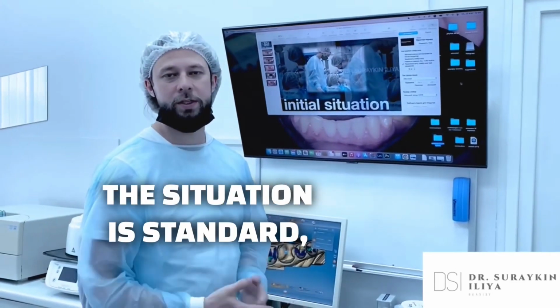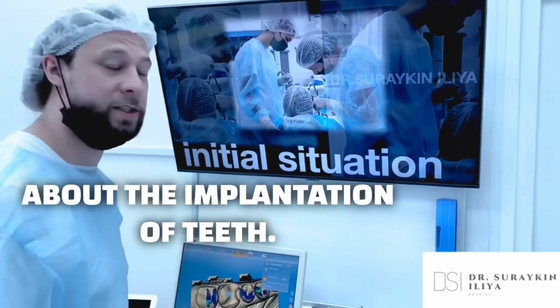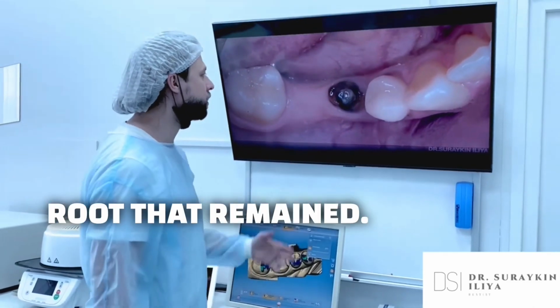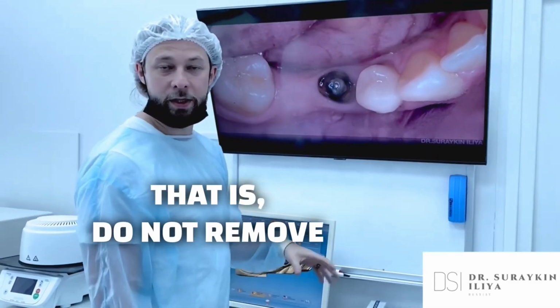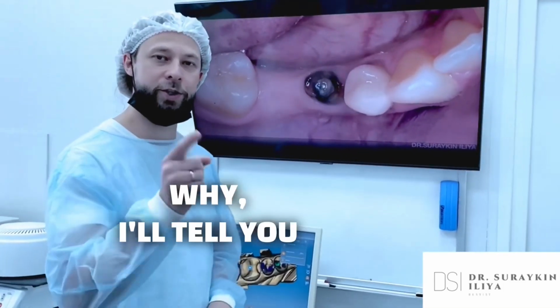The situation is standard. There are some difficulties, and now I want to show it. Just a simple presentation about the implantation of teeth. The patient came, the lower jaw, there is a small root that remained. I recommended that the patient leave it until the implantation. That is, do not remove it immediately, but remove it only at the time of implantation. Why, I'll tell you a little later.